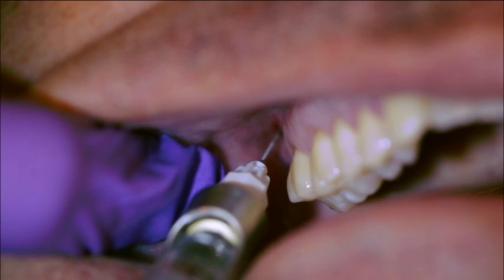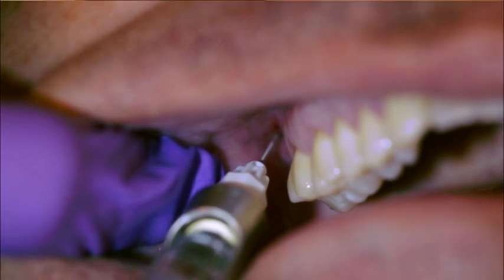Using a short needle at 16 millimeters or 3/4 the depth is recommended for most situations. The depth may be less for patients with smaller skull sizes or greater for those with larger skull sizes. You may need to adjust the angulation once the syringe is in the mouth, but before the needle enters the tissue. Do not move the needle in the tissue to establish correct angulation. You should feel no resistance or bony contact.